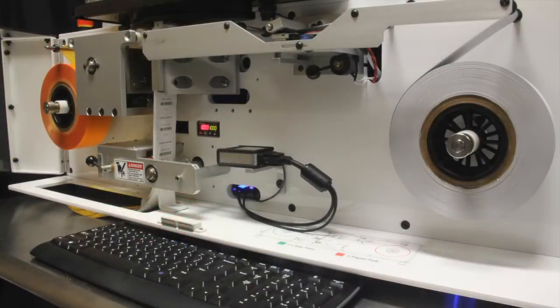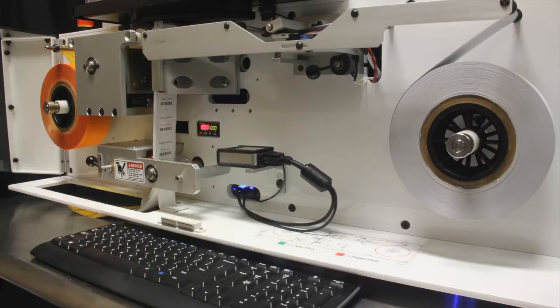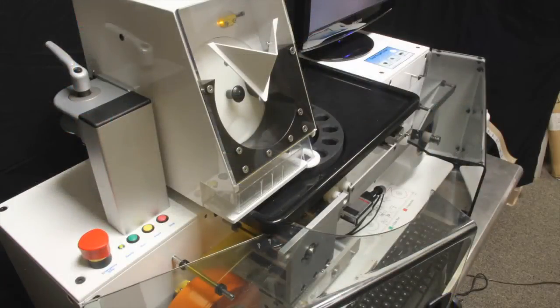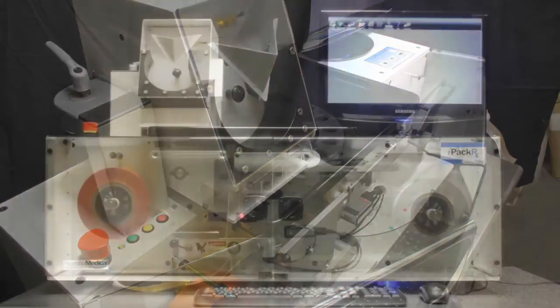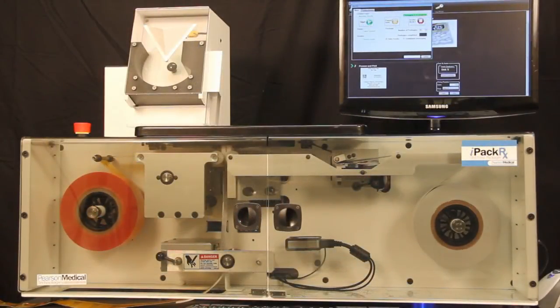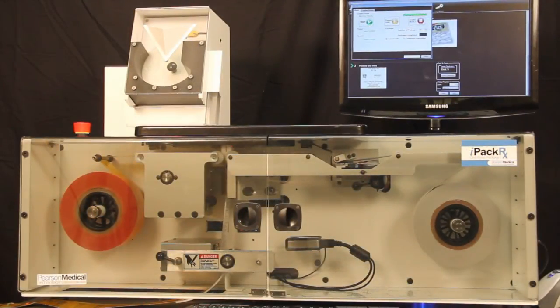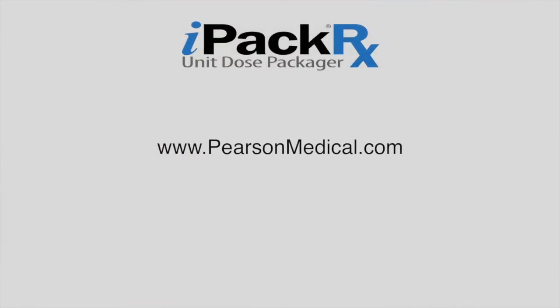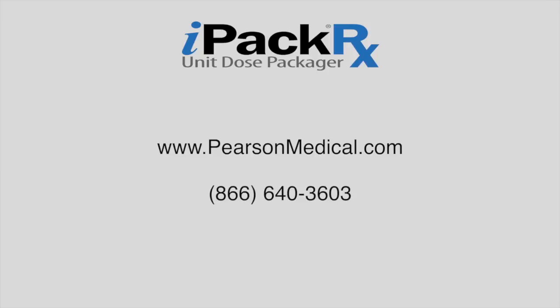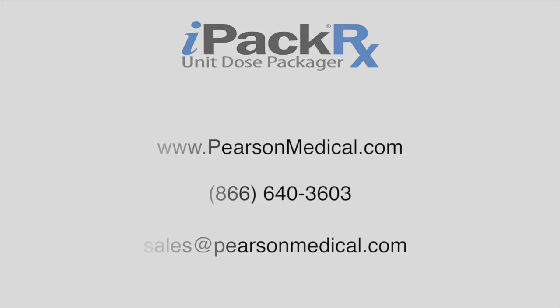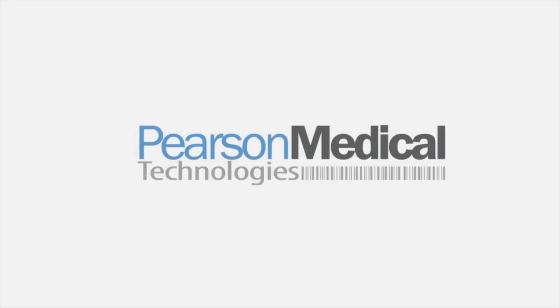No other tabletop unit dose packager offers the advanced features, 21st century technology, and unparalleled value of the IPAC-RX unit dose packager. To learn more about the IPAC-RX unit dose packager, including how affordable it is to own or lease this system, please contact Pearson Medical through our website, www.pearsonmedical.com, or by phone at 866-640-3603, or email us at sales at pearsonmedical.com.